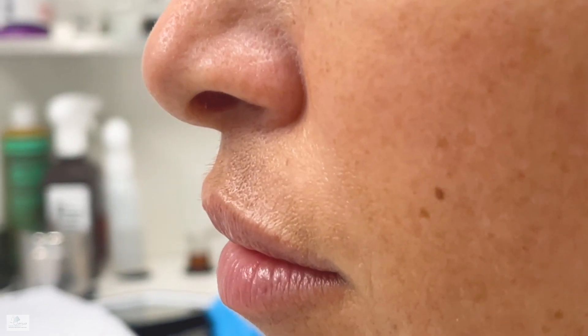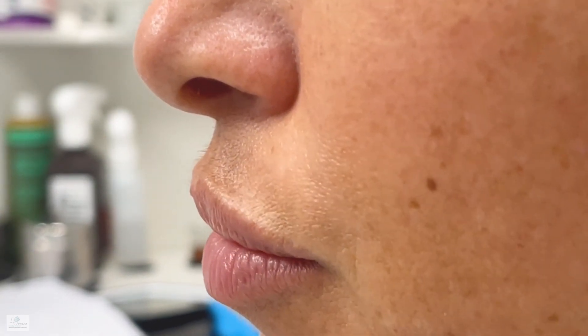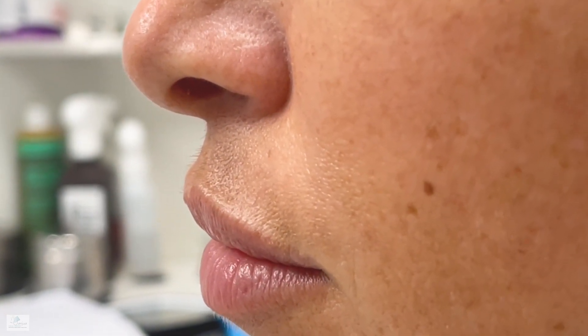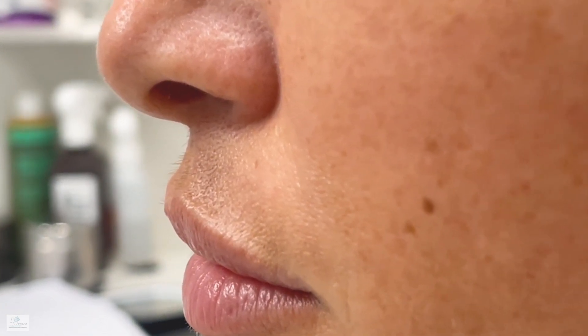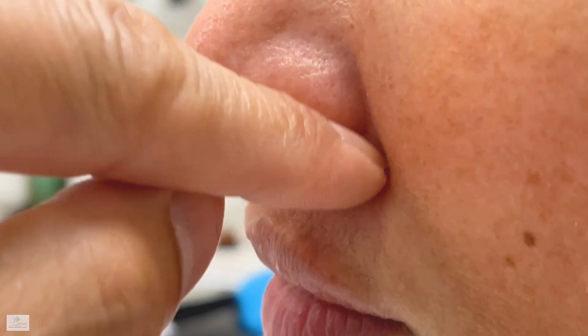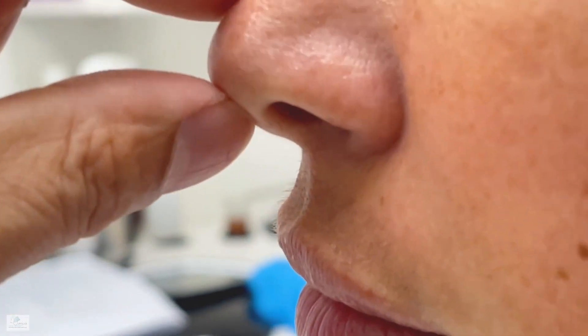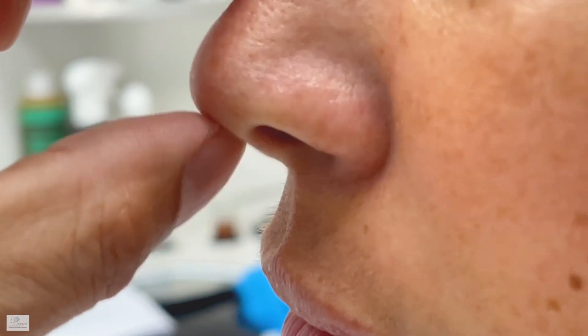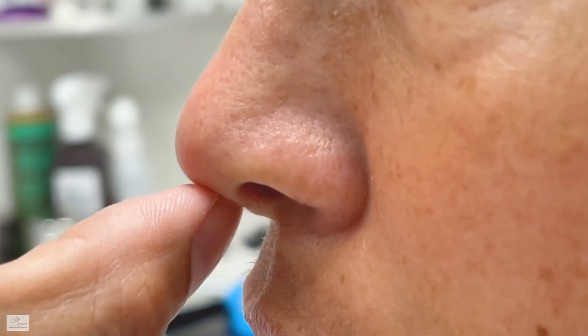Today we are doing a columnar reduction through the excision of membranous septum and maybe part of the medial crus. Think of it as a triangle with a base inside, and once you take that out it's going to push it inwards. That's what we want — it's going to make the nose look not so big or projected.